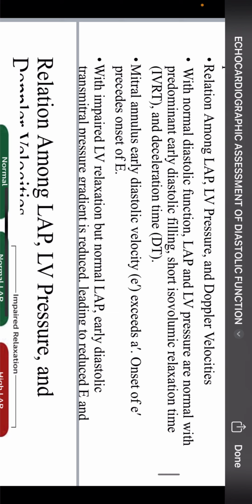No, because of relaxation, small E prime should occur before the inflow E. Relaxation, it moves, it expands, springs, comes back to its resting position. That is E prime. And then next, blood flows. But if relaxation is hampered, then blood will flow fast, and then the ventricle tries to expand. Again, I'm repeating, my mistake, I'm sorry. E prime, because of isovolumic relaxation, should happen fast. And then E, blood flow, next.